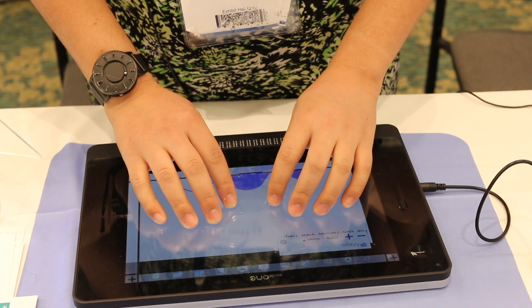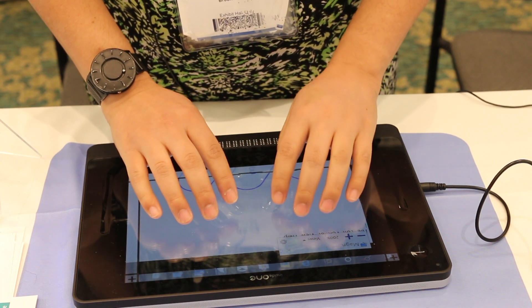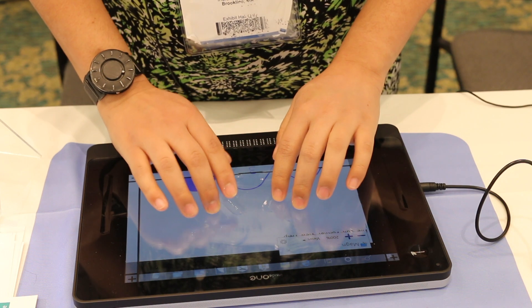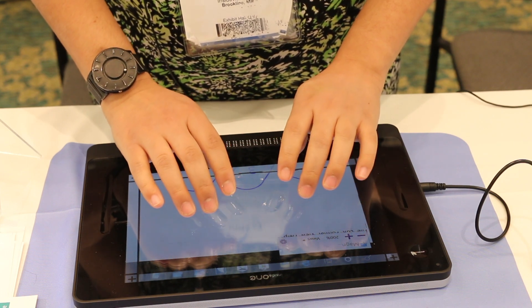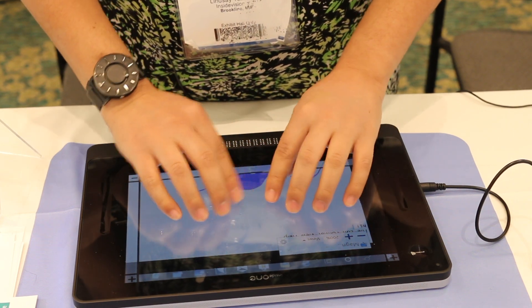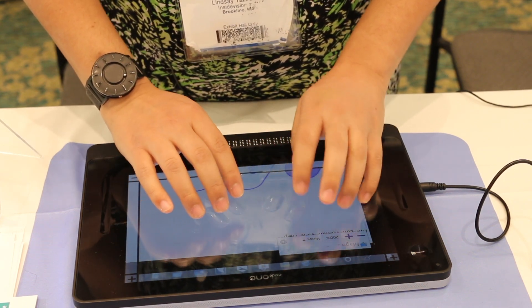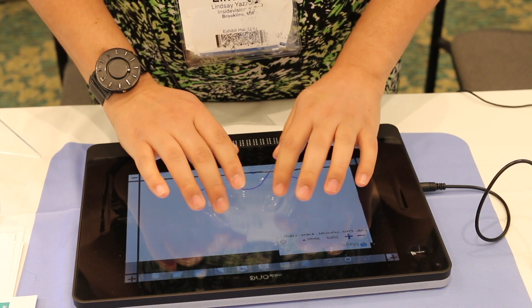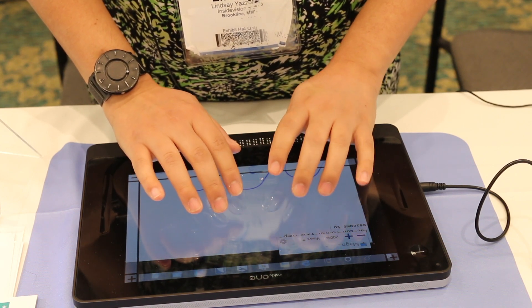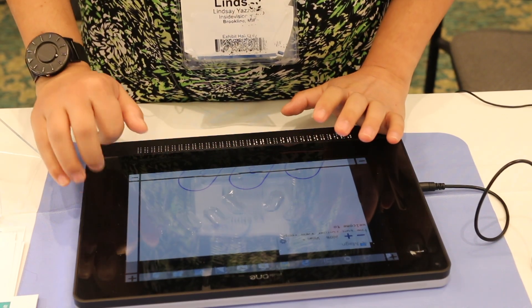So I have my hands on the keyboard now, and I can actually type in braille. I'm in a word file, so I can say hi, or I can say whatever I want. I can say welcome to ATIA.